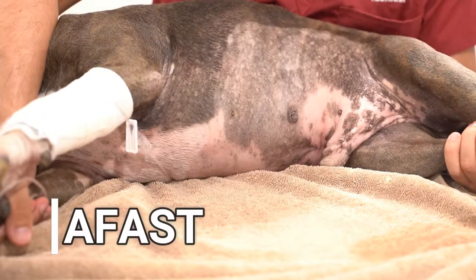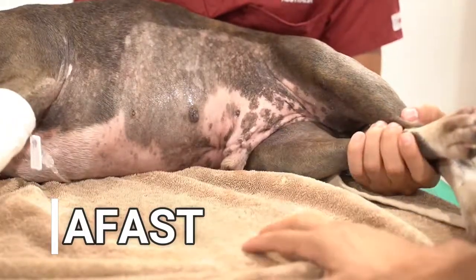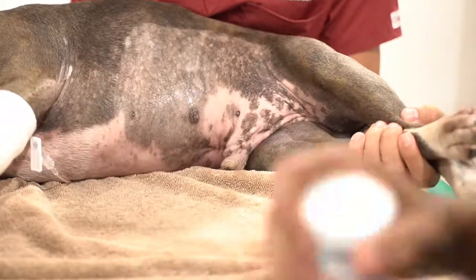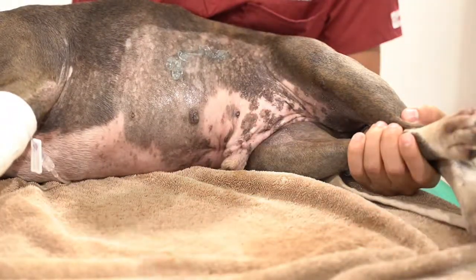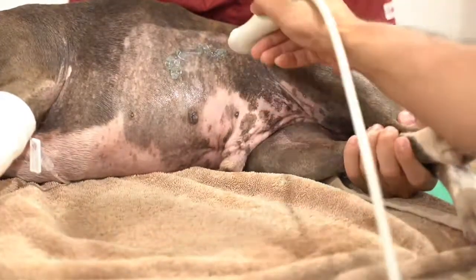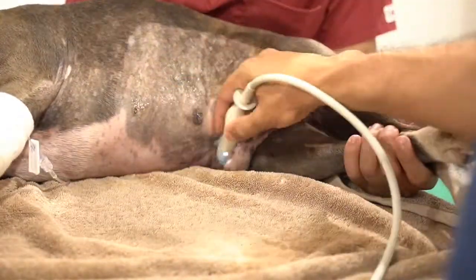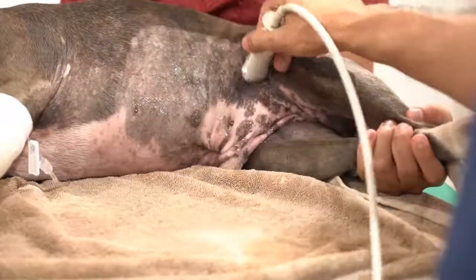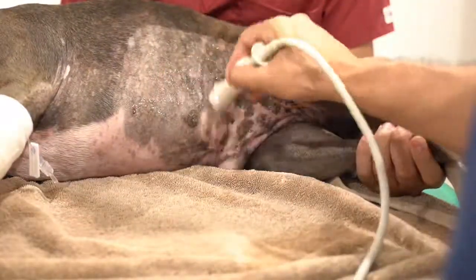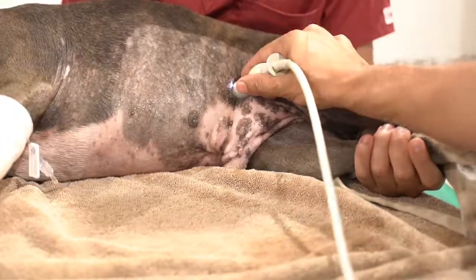We're doing an AFAST. We're starting with methylated spirits, which will help with the coupling of the gel to improve our image on the ultrasound. We place the patient in right lateral recumbency. You don't have to clip, but clipping does help, and I'll talk you through the ultrasound.